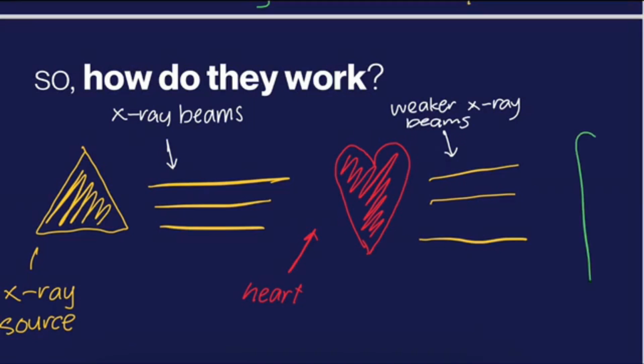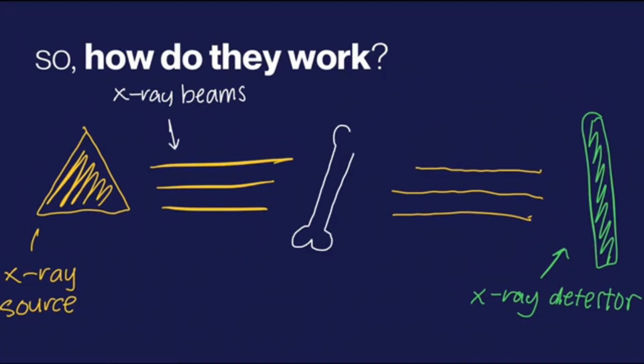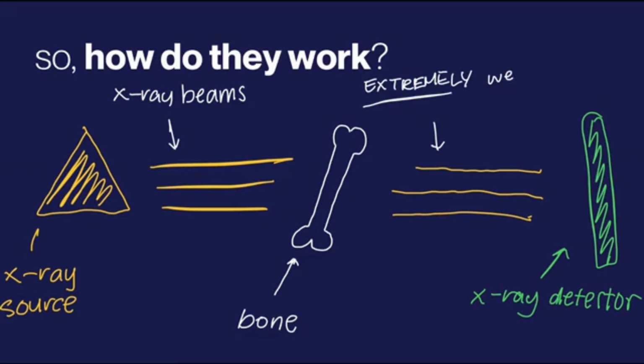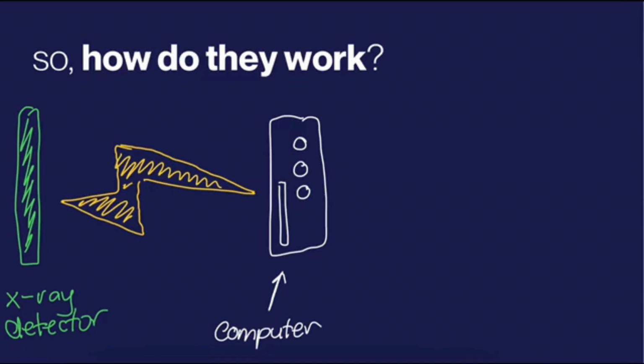an electrical signal. This signal depends on the amount of energy that is absorbed by the electrons that the X-rays collide with, as they can either lose some of their energy, such as in soft tissue, which appear grey, or can lose a majority, like in bones or metals, which stand out in white. The electrical signal made by the detector can then be interpreted by a computer to produce an image.